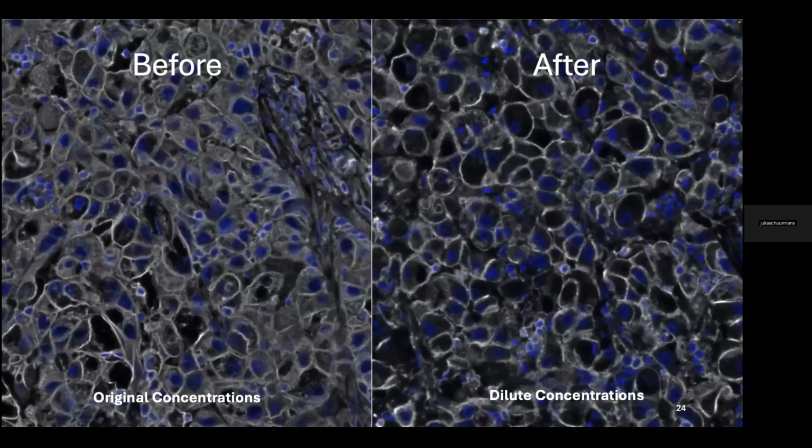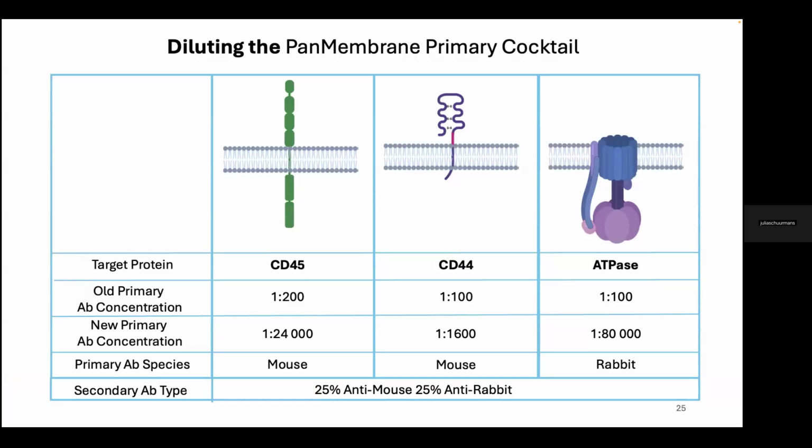And by doing that, I was able to remove most of the background staining. If we look at it again here, we'll see I get much crisper outlining of the larger cells, just largely absent over here. And yeah, it worked. It was exciting. And so to give you guys some numbers of what I was working with, for CD45 and CD44, I was at a 1 to 200 to a 1 to 100 concentration. I brought those both down significantly to 1 to 24,000 and 1 to 1,600. Then with ATPase, the workhorse of my cocktail, I had to dilute that down quite a bit. I was getting a lot of background staining from this specific marker. I brought it down to 1 to 80,000.